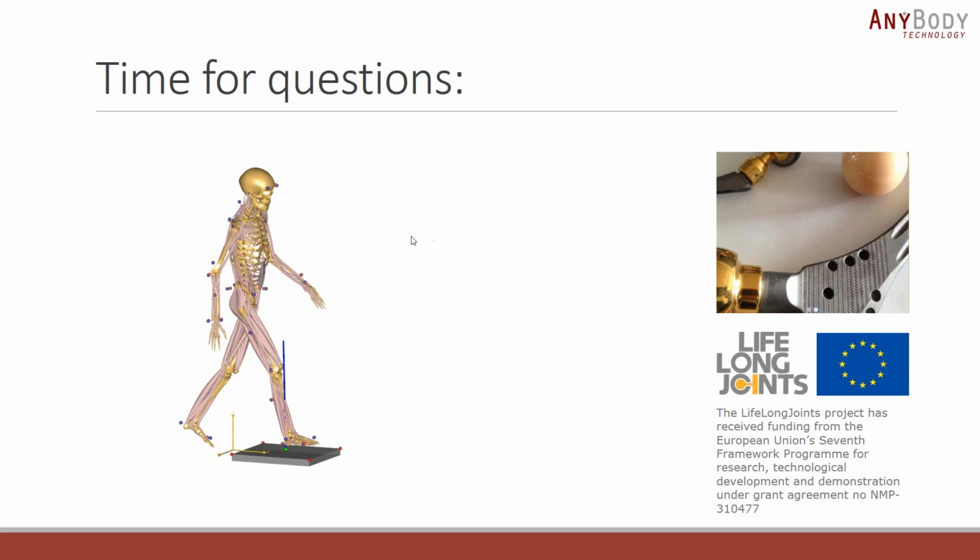But one thing that we were looking to do when we look at a 24-hour loading cycle was look at a highly active patient and perform the 24-hour loading cycle, and also look at a low active patient, so maybe performing more breaks within the 24-hour loading cycle, or fewer gait cycles as part of the loading pattern. I think that would possibly come out of that. So the amount of activity that our patients are doing maybe could have an effect, certainly on the wear rate. But again, that'd be much more for Richard and Rob Beadling over at University of Leeds to explore, I guess. But it certainly is possible.